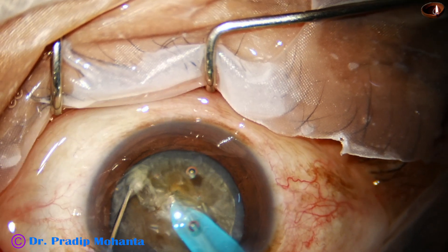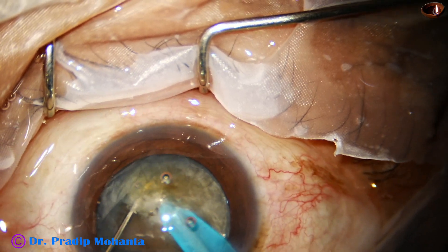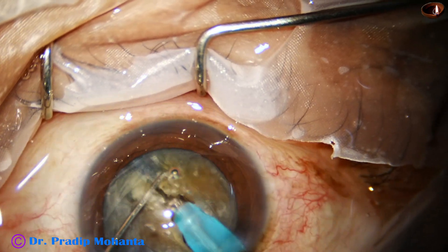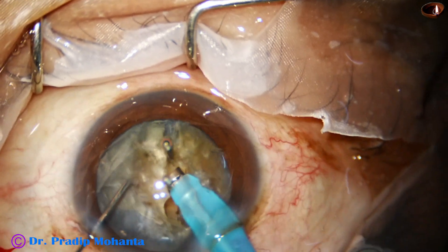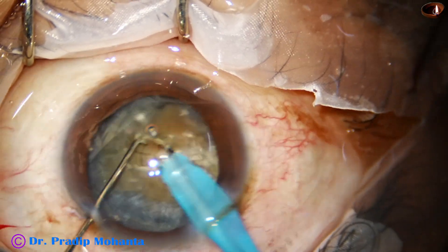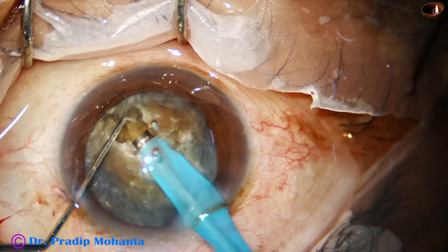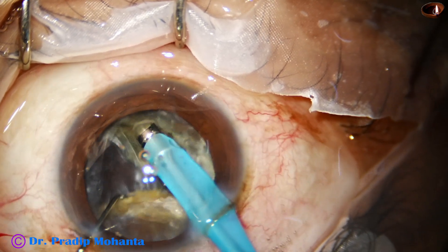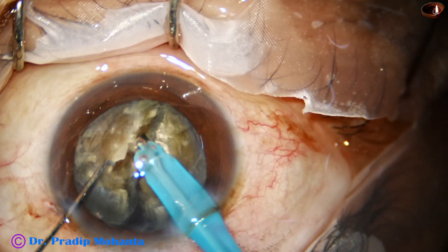And now the chopper is used to make a nice crack. A very good crack has been obtained. We rotate it 180 degrees, come to the other side, do a deep sculpt, hold on the hemi-nucleus, and separate the two hemi-nuclei completely.